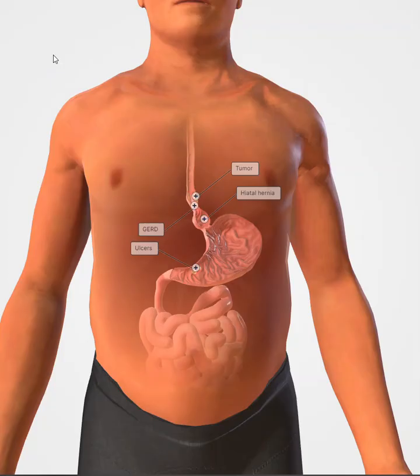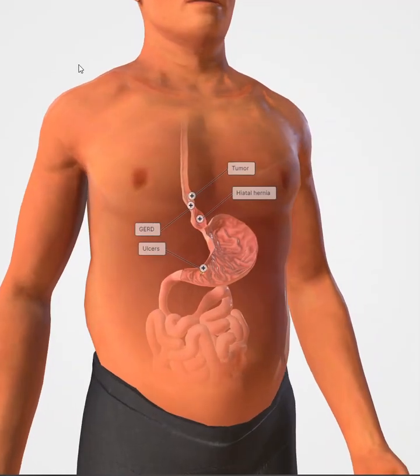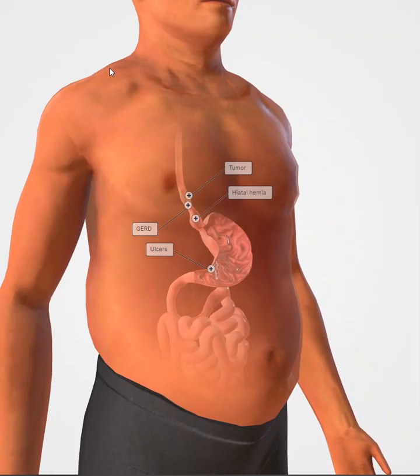which would be an AP projection. So I'm going to rotate the patient into what we would call a left posterior oblique, LPO, meaning the left posterior side will be against the table. I'm just going to rotate him around. His right arm is coming towards us. That is an LPO position. So what we're looking for is this duodenal bulb here in profile.